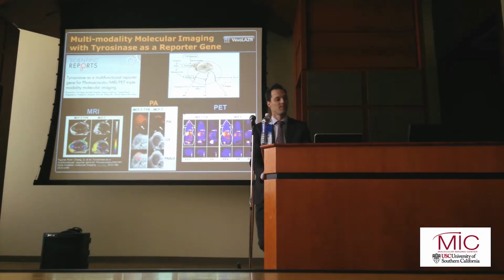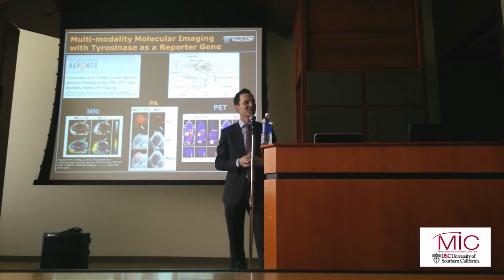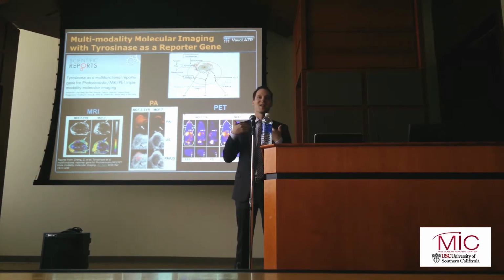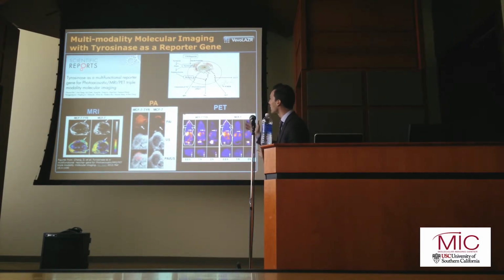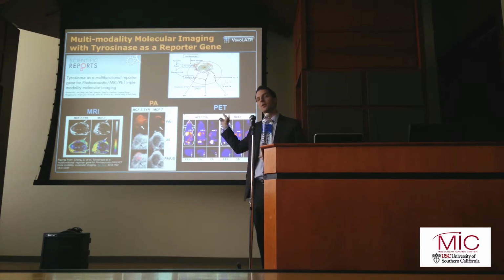Very powerful tool. Kind of, I think, to Roger's chagrin, this was published a few months prior in Scientific Reports as well by a group at Stanford. And the reason I'm putting this up is that they did a nice job as well. They did the same thing. I don't think it was inducible, but they had melanin production in tumors. And they used multiple modalities to be able to see it: MRI, PET, and photoacoustics.